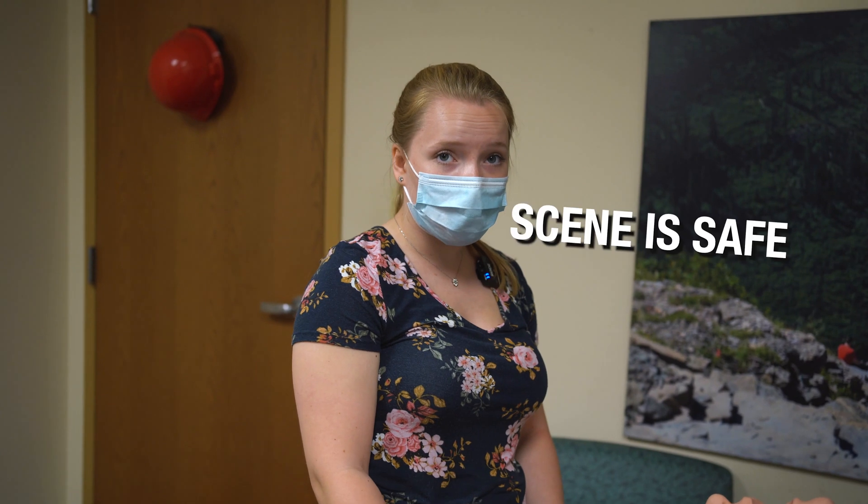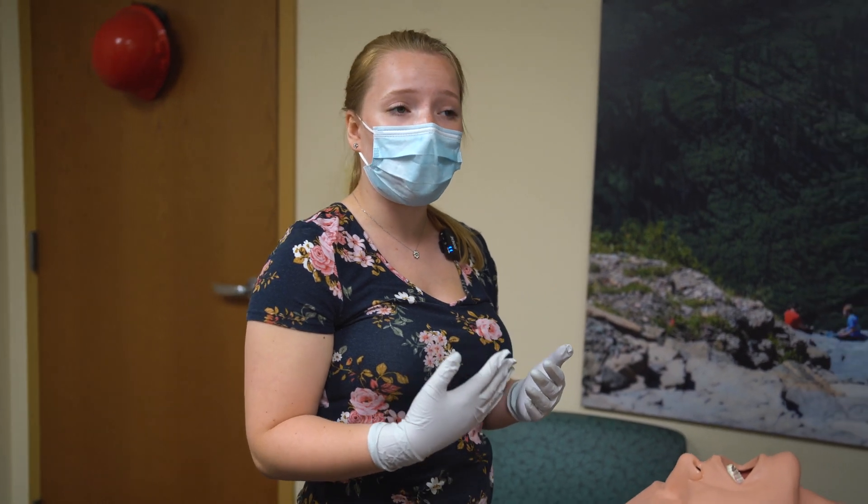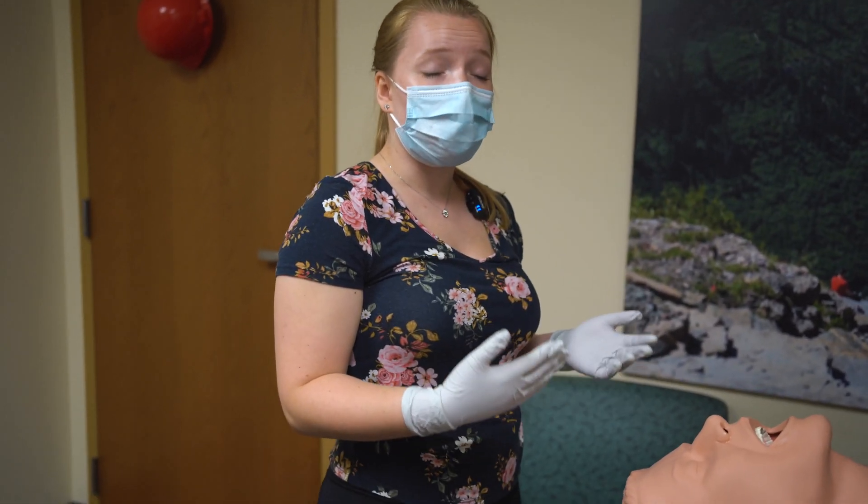Starting off, I'm going to arrive on scene and ensure my scene is safe. Is my scene safe? Scene is safe. Then I'm going to make sure I have the proper PPE — so I have my gloves, my mask, and for full PPE while managing an airway, we would have our eye protection and our gown as well.